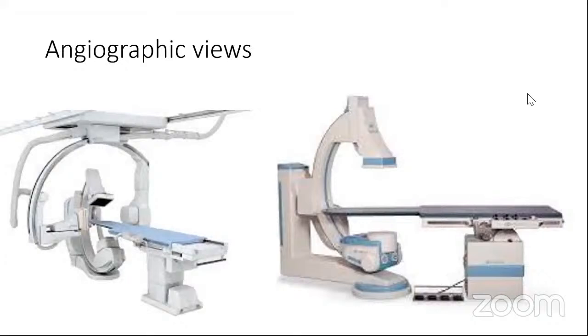Angiographic views. This is the angiography machine. This part is called the tube, which is the radiation source. And this is called the image intensifier. Now, when imagining the views, I like to neglect this and just focus on the intensifier as the camera. That way I can picture the views and imagine them in my mind.